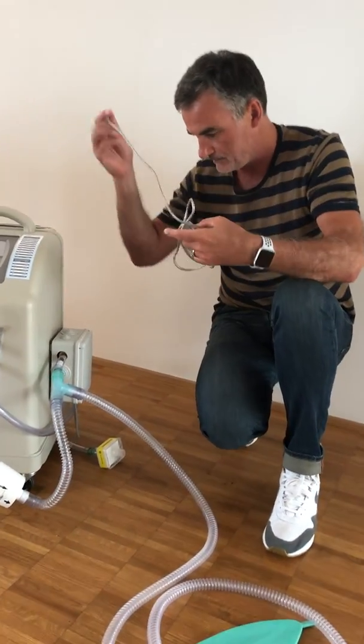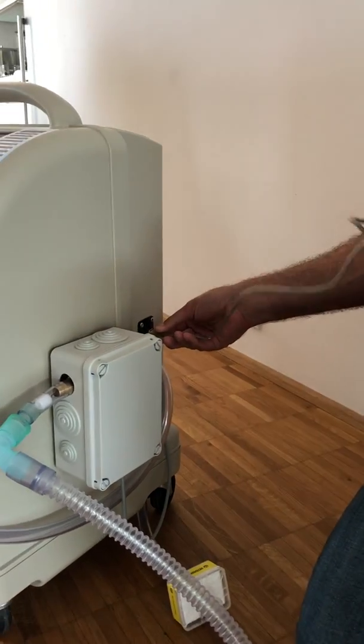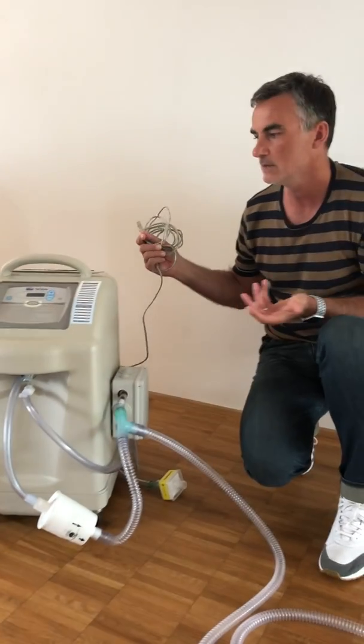At least you have to make the connection with the USB — you have a USB port here. Connect it to the PC, and you are finished.